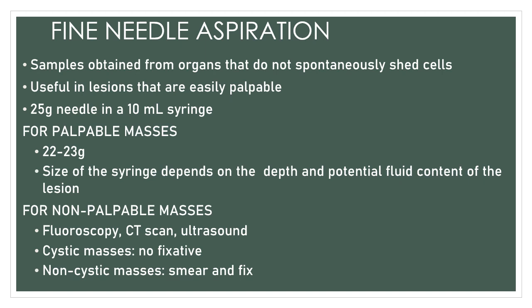This is actually useful in lesions that are easily palpable, like growths of the skin, subcutaneous soft tissue tumors, thyroid tumors, lymph nodes, salivary glands, and breast. Generally, fine needle aspiration uses a 25 gauge needle and a 10 ml syringe.